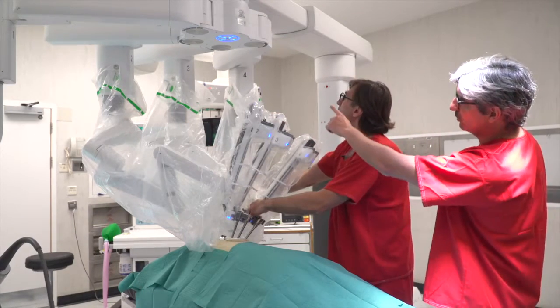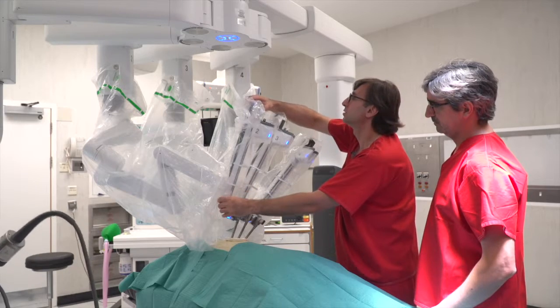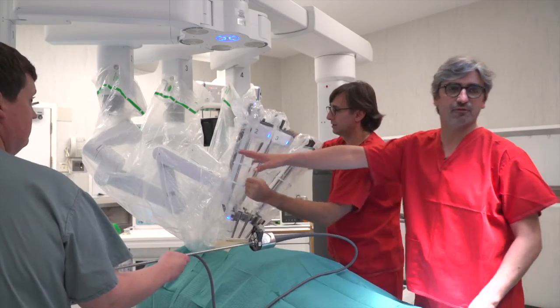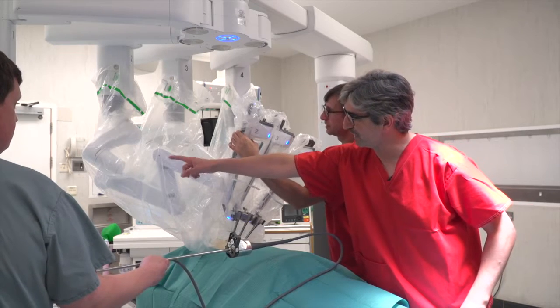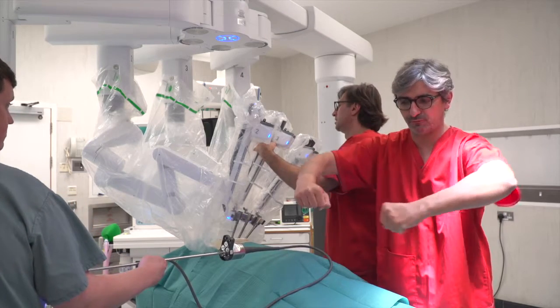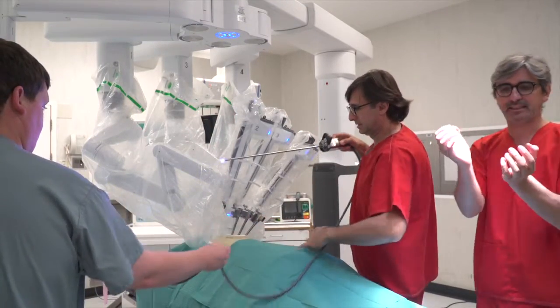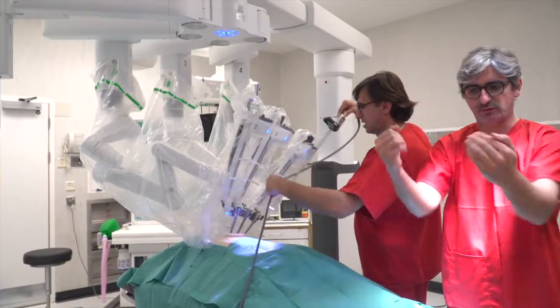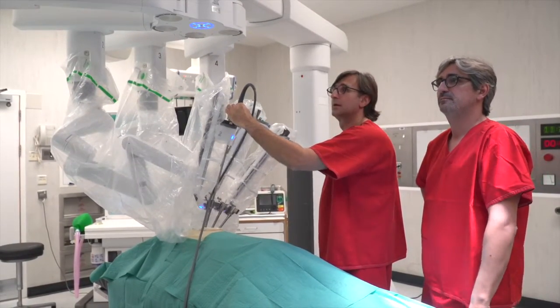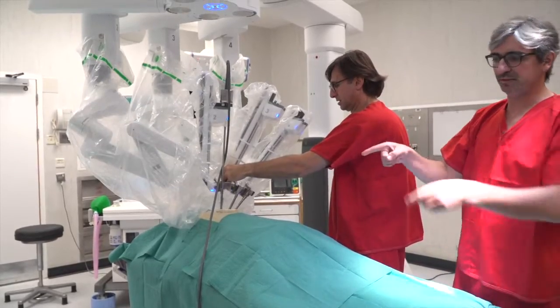Camera, please. Now the clearance — this is the clearance, we need to do clearance here. The distance is good, but we need to move the elbow and have more space. Because if they are too close, there will be more collision. You have to move like this to have the space between the joints. You have to be sure that the clearance is always open — not like this, otherwise we collide. Camera in the upper part always — this is a very important concept. And the instruments below, parallel.